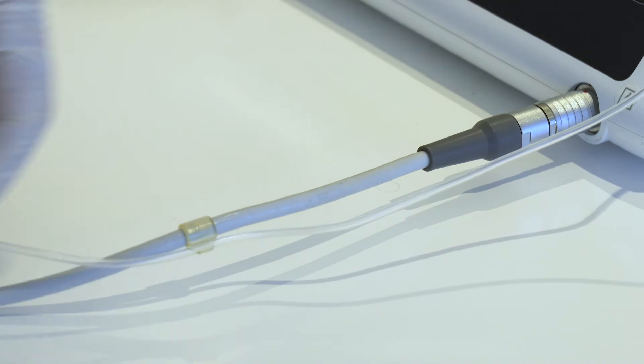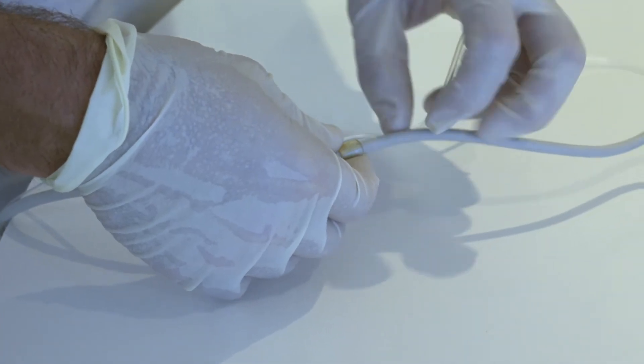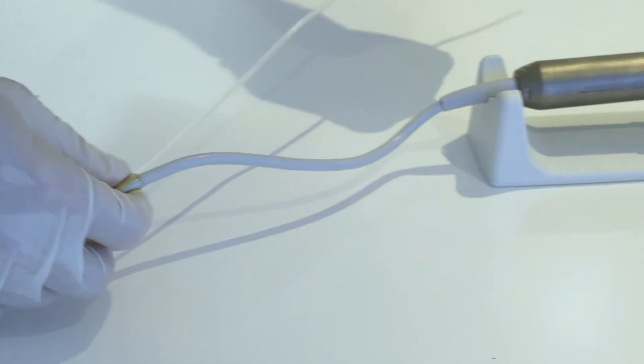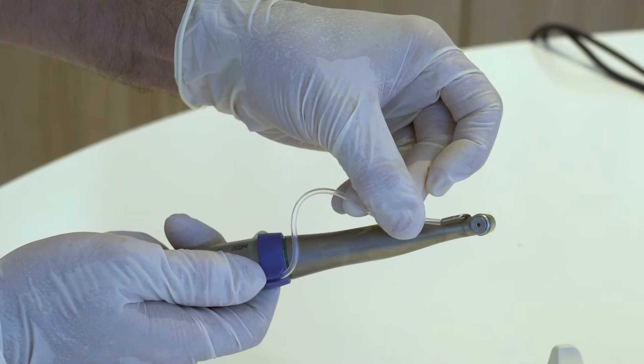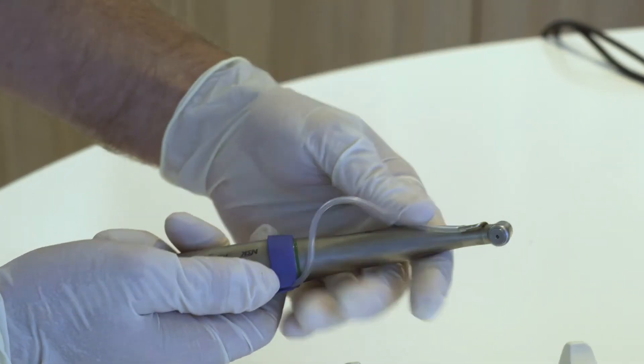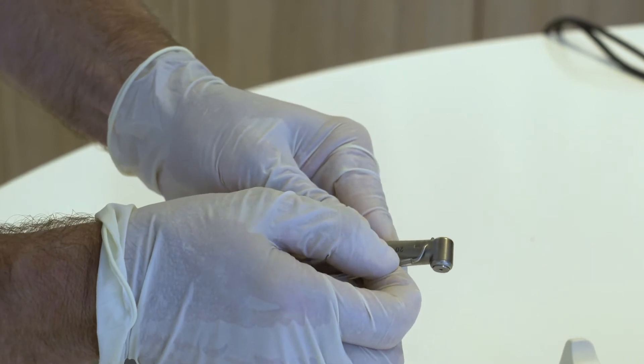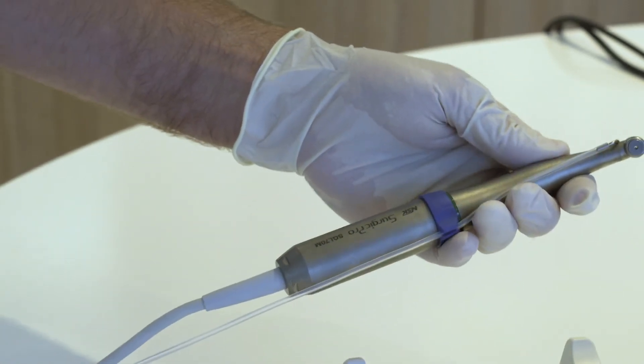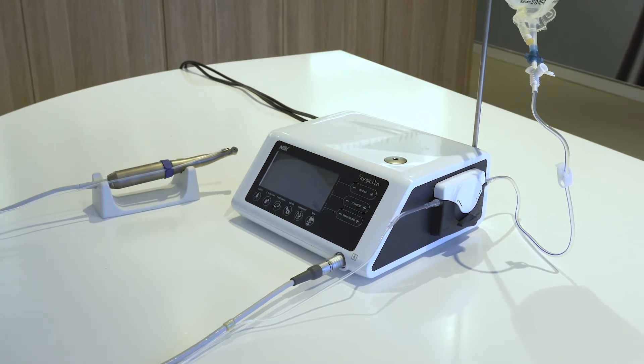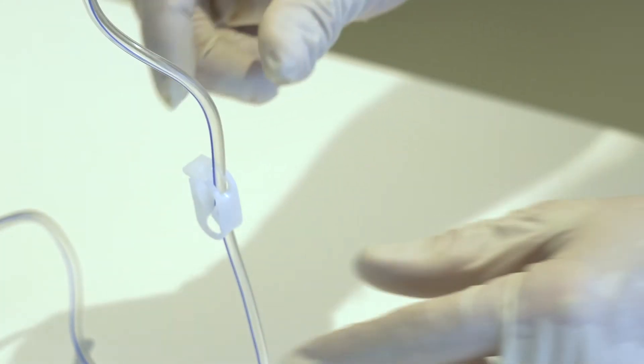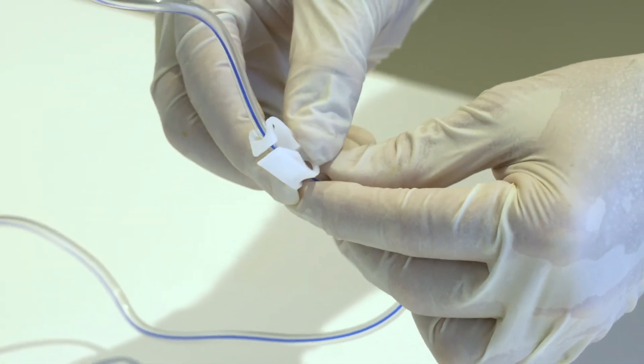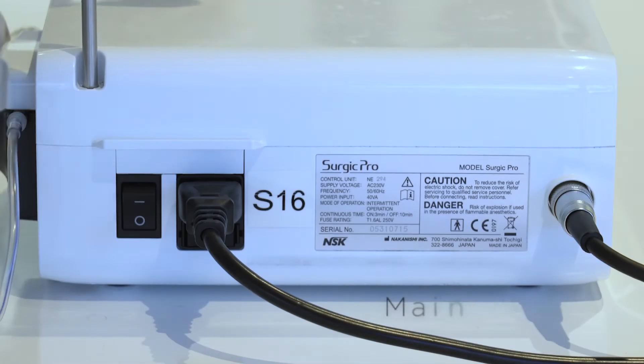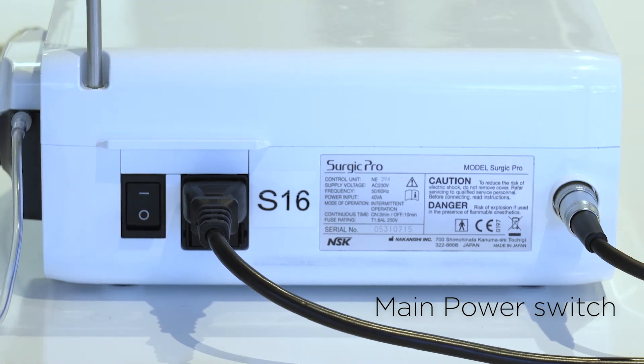Insert the irrigation tube into the tube holders, motor and handpiece. Open the tube clamp.